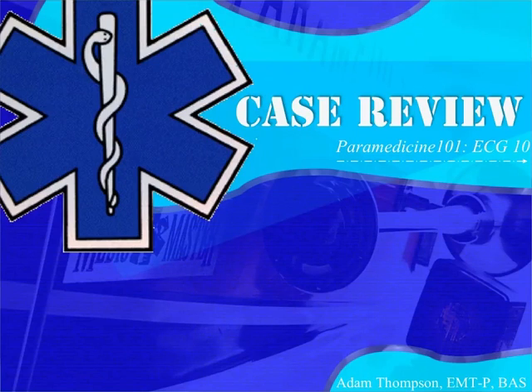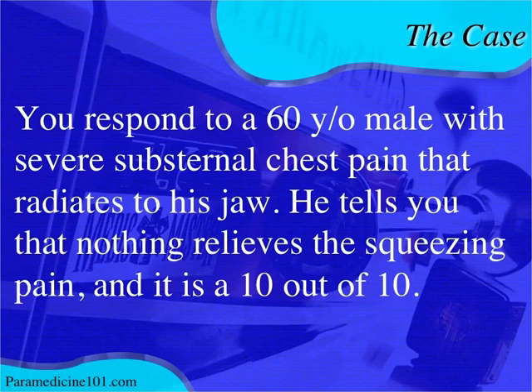Hello, this is ECG case number 10. Let's get started and take a look at the case scenario. You respond to a 60-year-old male. He's got substernal chest pain. He tells you it radiates to his jaw, and nothing makes this pain any better. It feels like it's squeezing, and it's a 10 out of 10.